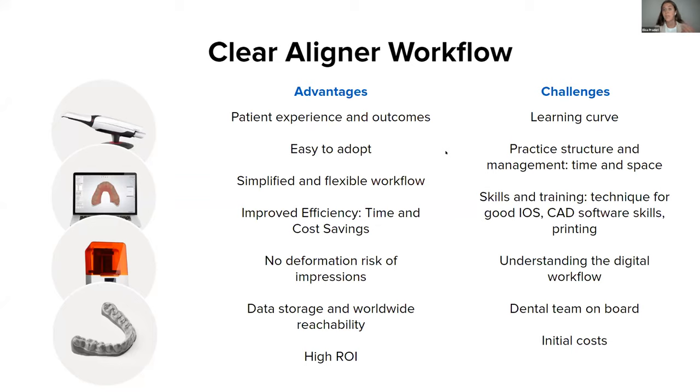We know that sometimes we take an impression, and if it's alginate, we have a specific time within which we need to pour the plaster to prepare the plaster model. This is not the case anymore. It reduces that step and the potential alterations of that model. So we achieve a physical model that is going to be static in its measurements if we did everything correctly in the intraoral scanning part, of course. That is something very important to bear in mind.